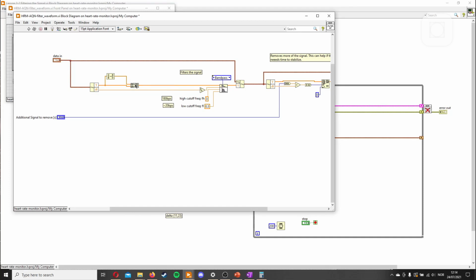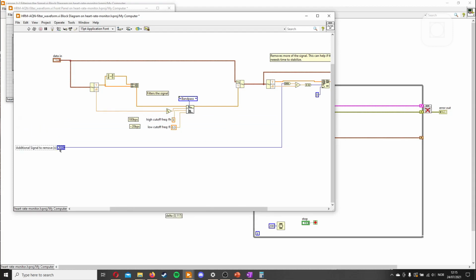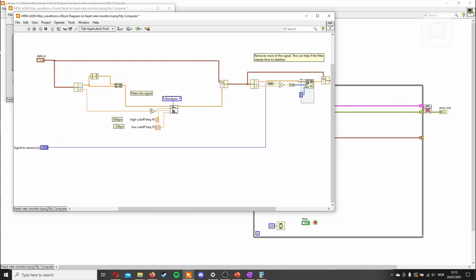In this way, we now have twice the amount of signal for the filter to work on, but it's the same frequencies, so we don't add anything to it. The only thing we need to do now is to just remove the extra part. So we'll just put this here. We can move this one a little bit down here. And we'll do that just by this same VI, so I'll just copy it in here.